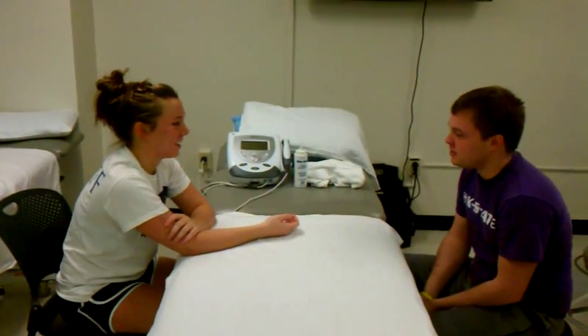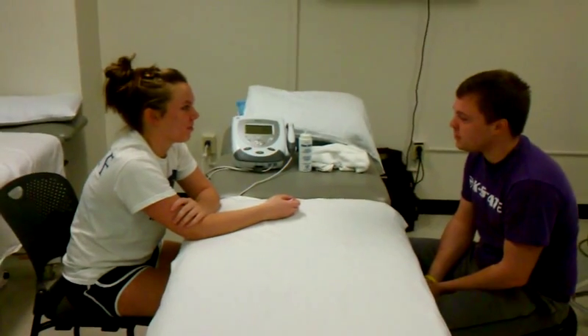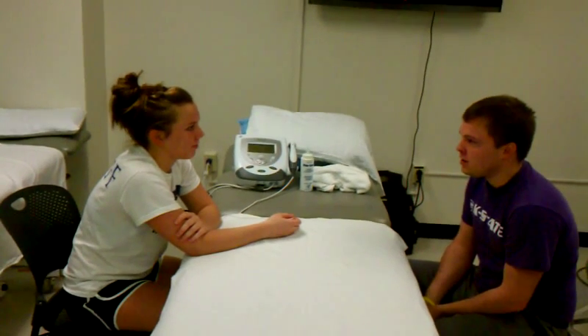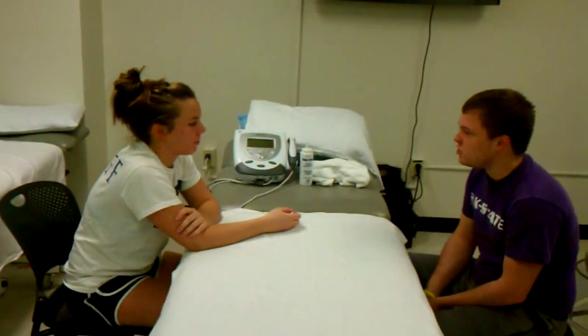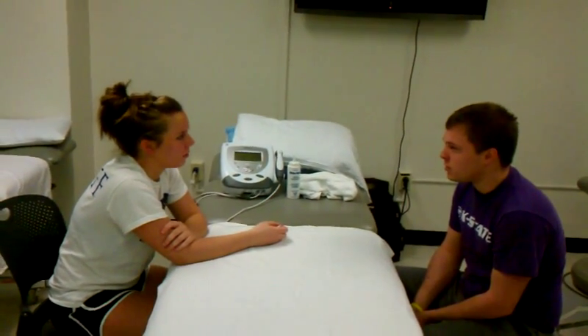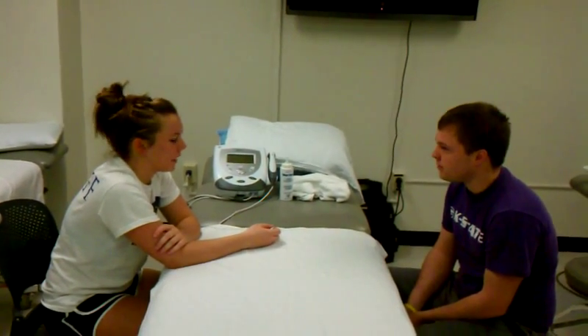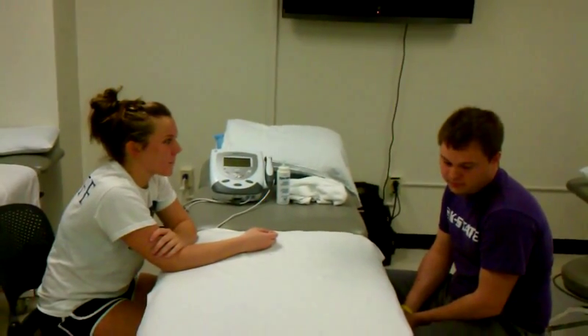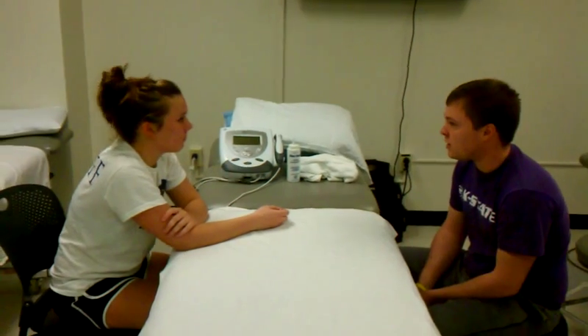I'm okay. You're okay? I see you came in with some carpal tunnel syndrome. Is that still hurting today? Yeah, not terrible, but yeah. Do you have any sensation issues or loss of vascular? I don't think so. I haven't seen any so far. No cancer, nothing like that? Good.